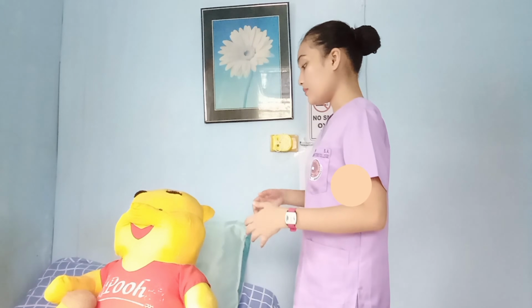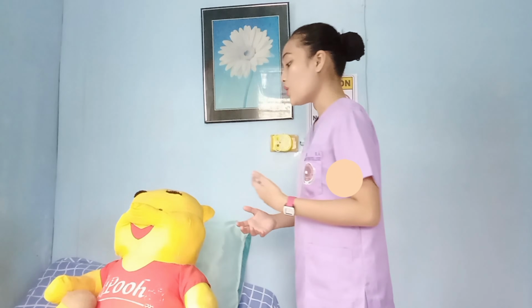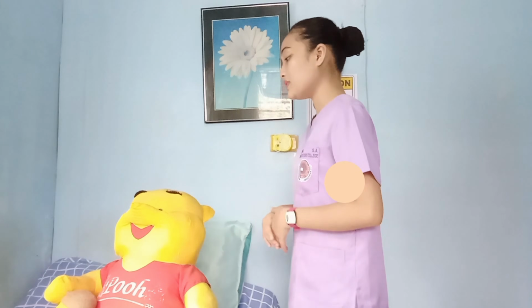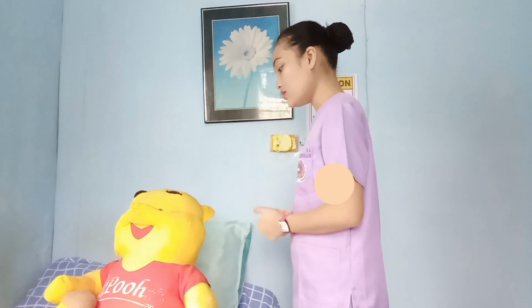Okay. So, as per your doctor's order, we'll be giving you supplemental oxygen. We have noticed that your oxygen saturations are quite below normal, and so we are going to try and correct that by giving you oxygen. You don't have to worry, you just have to relax. We'll be using nasal cannula. This procedure will not hurt at all. And it will not restrict your ability to eat or speak or to move, but I still encourage you to move more carefully to avoid accidentally removing the nasal cannula that we'll be placing inside your nostrils. Do you have any questions?